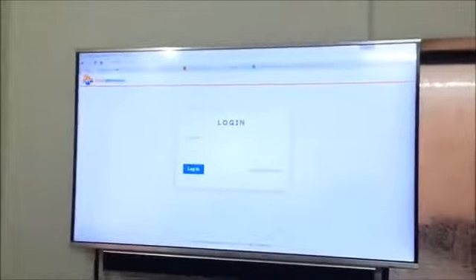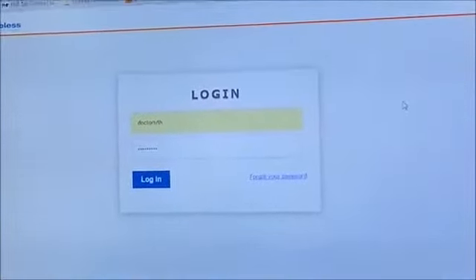What benefit it provides is that it works in real time. It takes all the data and shows it on the cloud. So it helps in real-time live remote monitoring. What you will see here is that we are uploading the ECG data, which is live connected from the patient, and immediately you can see it on the cloud portal.